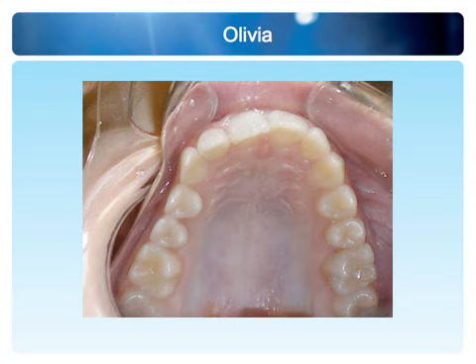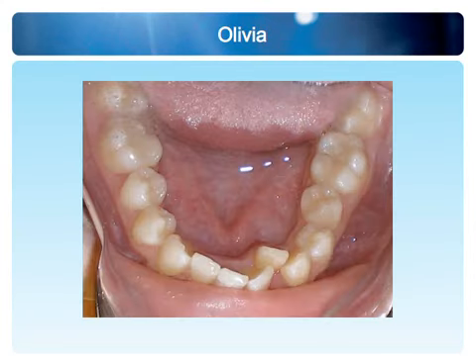I can see the photograph is a little blurry over here. I apologize, I obviously took that photo. This arch form is not correct, and if we had a perfect arch form here, that would go a long way to helping us with what's happening here.